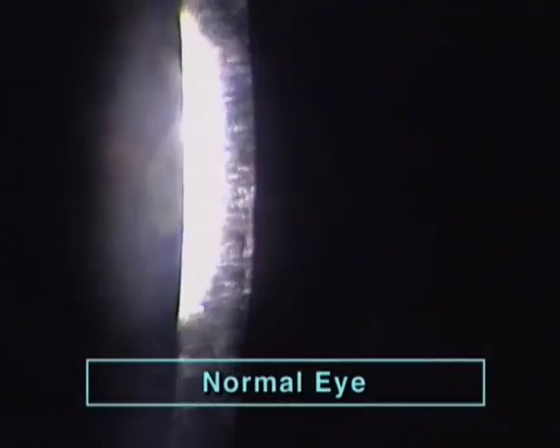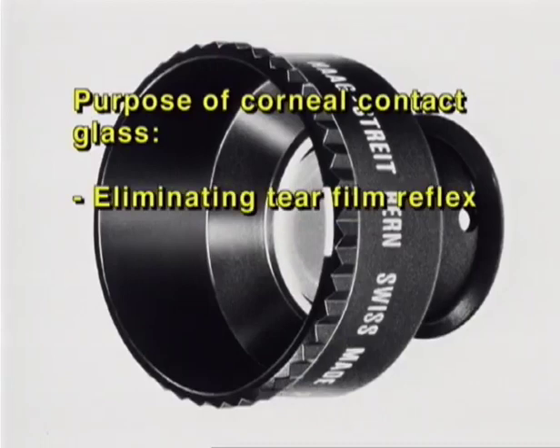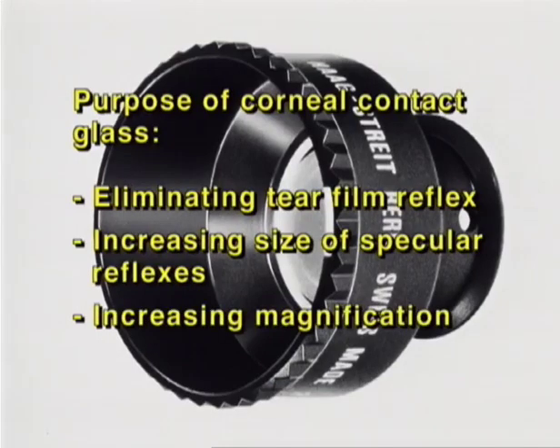This example shows that the anterior reflex disturbs the view. The posterior specular reflex appears only if the anterior reflex has been moved laterally, and then we can make out the endothelial cells. The contact glass is another way to eliminate the tear film reflex. Furthermore, it increases the size of the specular reflexes and increases magnification.